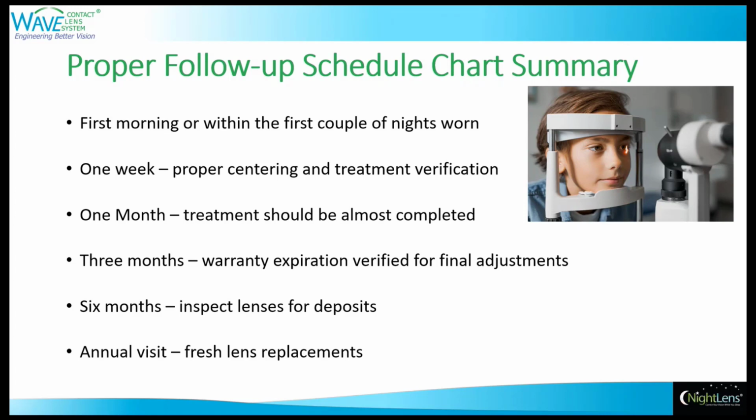Your 6-month schedule, you need to definitely have the patient bring the lenses with them so that you can inspect them for deposits or scratches or any type of surface issues. And then, of course, your annual visit, where you will provide the patient with new or fresh lenses for their next year of wear.